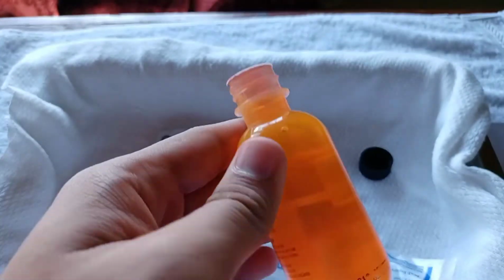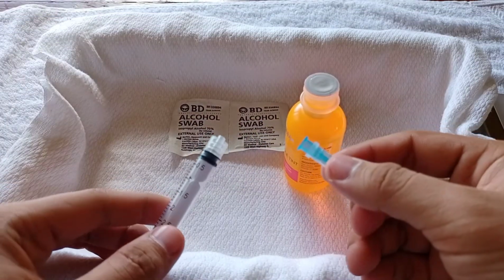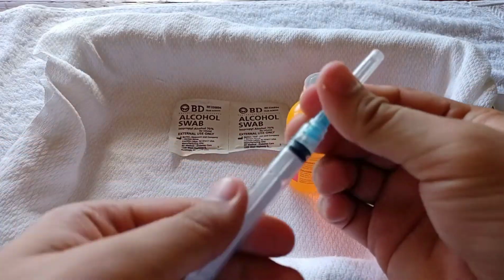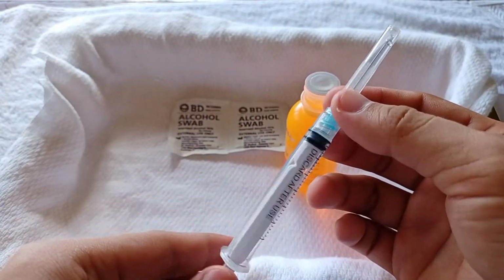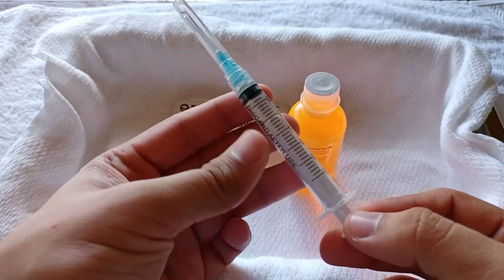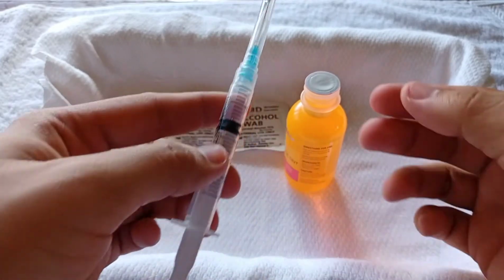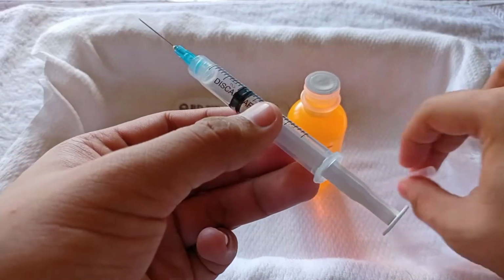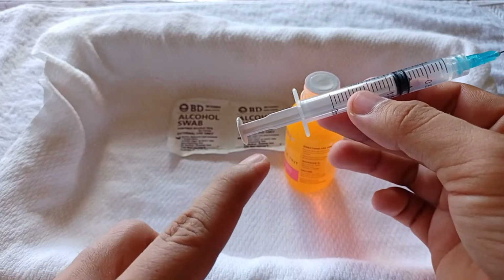So you're going to dilute or reconstitute the powdered drug in the vial. Put the amount needed for injection, then remove the cap if necessary. Do not touch the inside of the plunger.